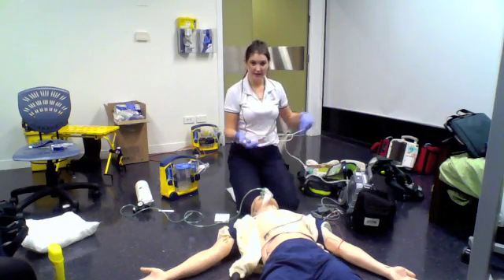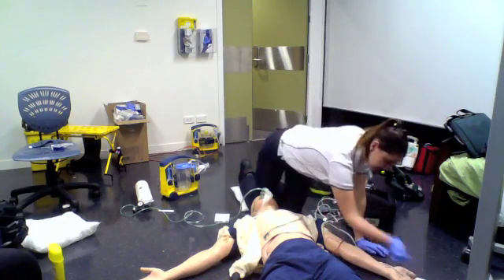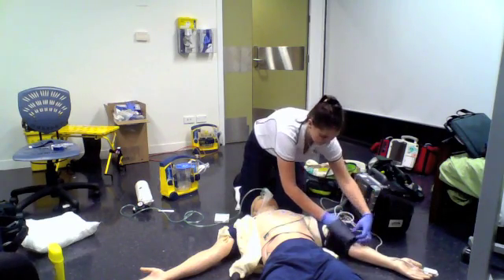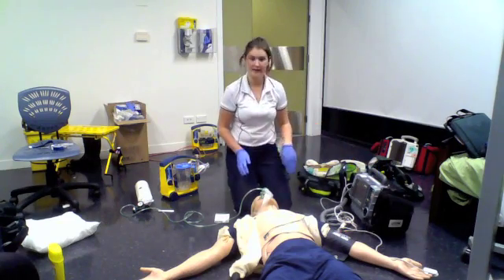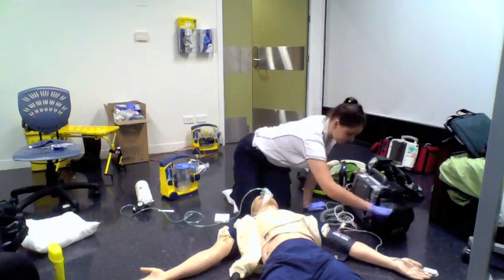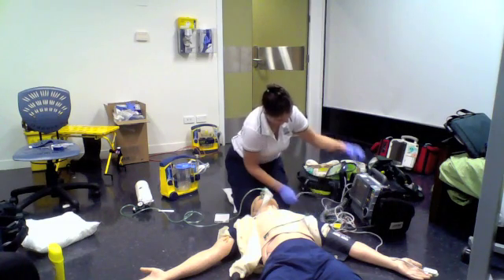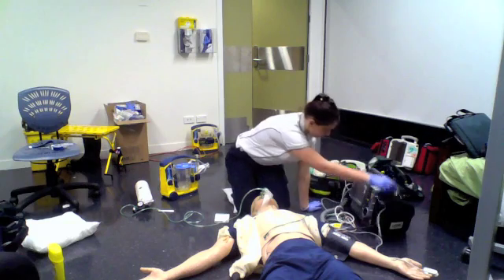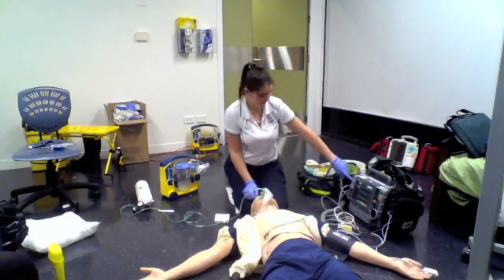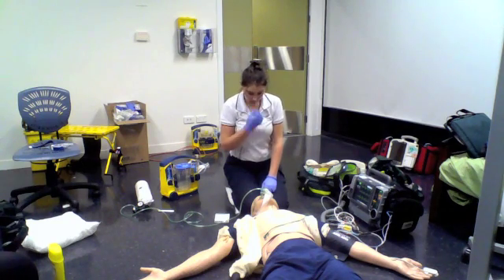So I've attached my 3 lead and I'm putting SpO2 on, which is super important for this guy. Blood pressure, SpO2, ECG, all of that. And I've got the monitor here nice and clear where I can see it. I'm not sure if you can see, but on the monitor he's in a normal sinus rhythm with a heart rate of 50 beats per minute.